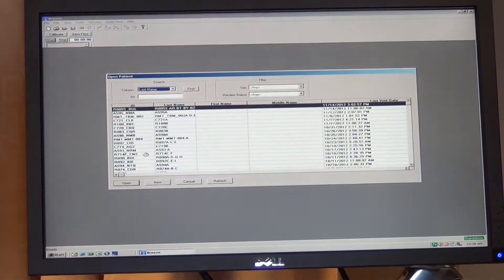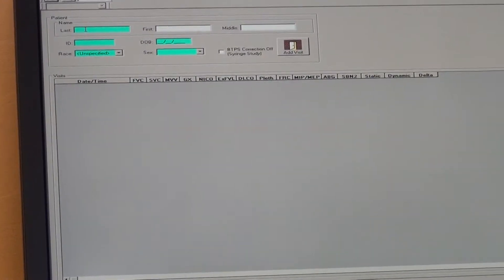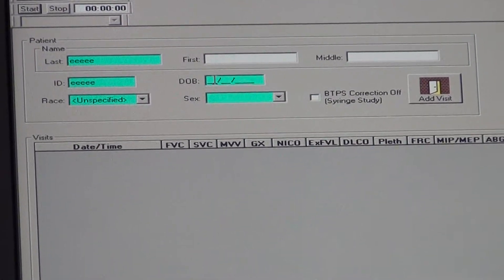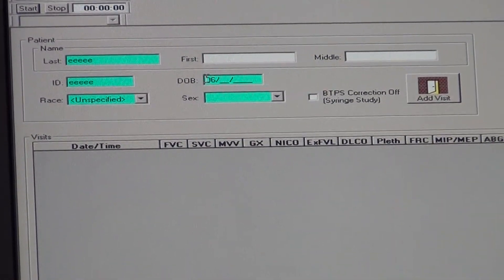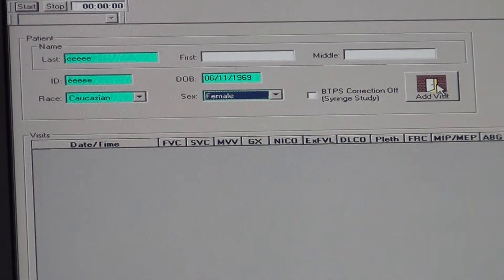After the calibration is done, go to Open and select New for a new patient. Enter the research ID where the last name is highlighted. This is a test run, so we're just going to put some information in there. Then enter the date of birth of the subject, the race, and the sex of the subject, and then press Add Visit.